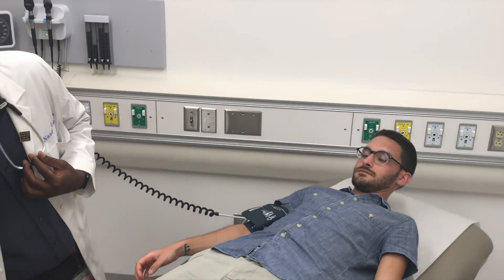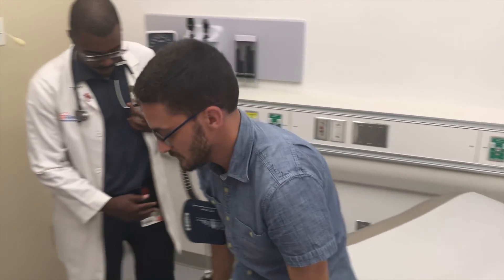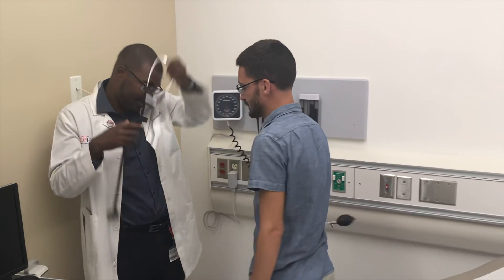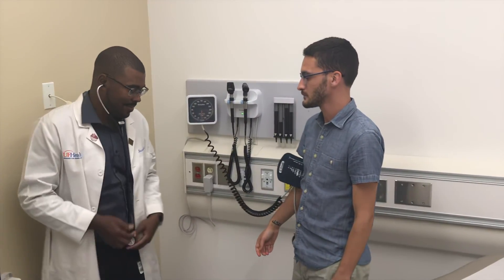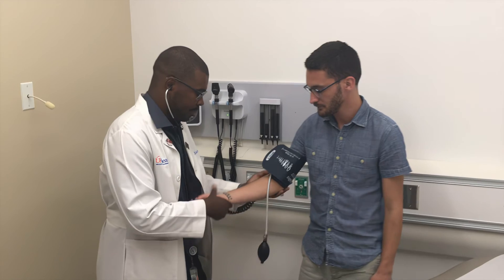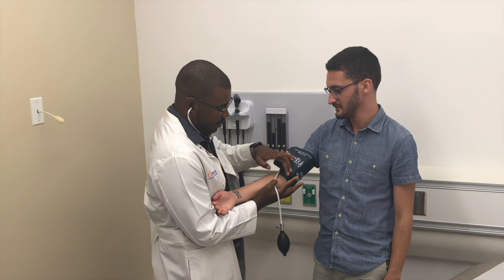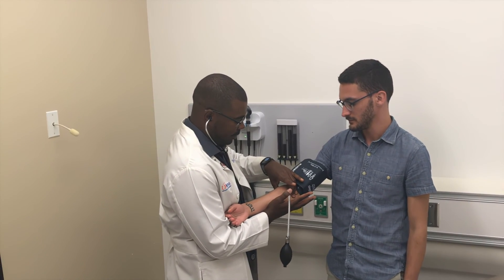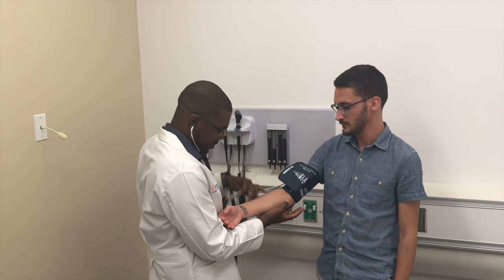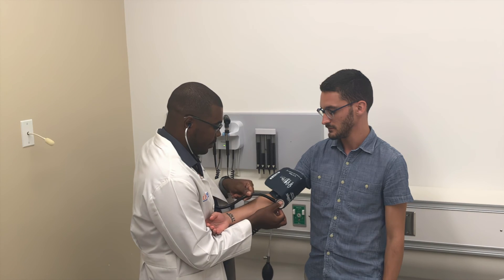As soon as you've finished recording the supine blood pressure, instruct the patient to stand up. Once the patient is standing, immediately retake the blood pressure within three minutes of having them stand up and record the standing blood pressure. A patient has orthostatic hypotension if they experience a drop in their systolic pressure greater than or equal to 20, or a drop in their diastolic pressure greater than or equal to 10 after standing up.